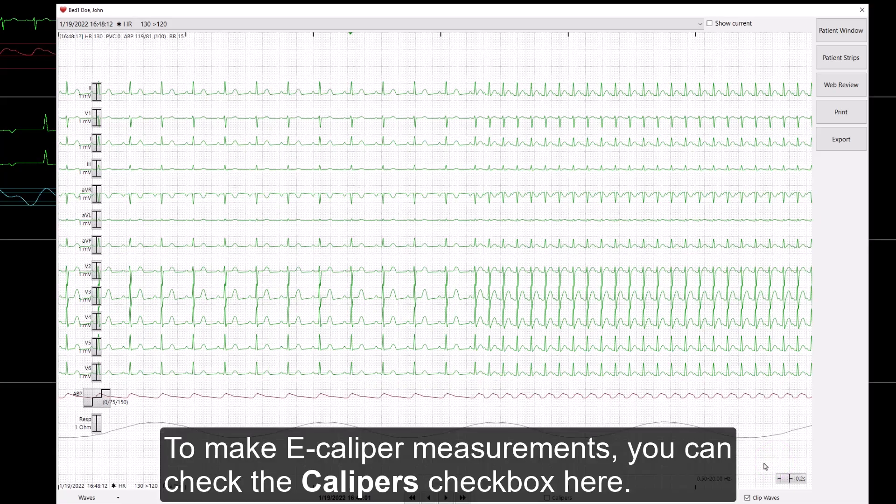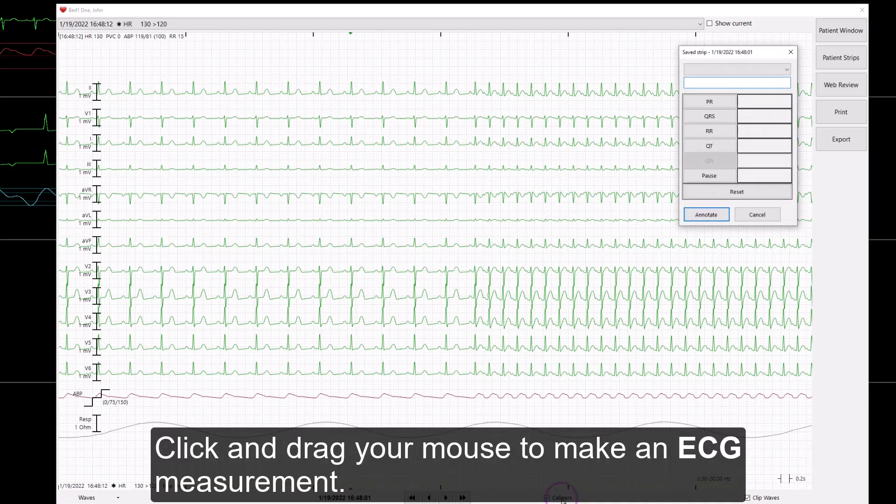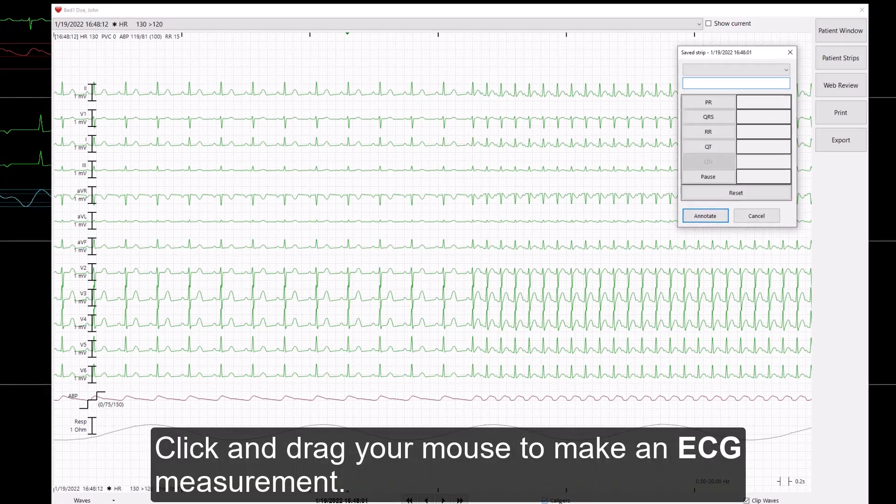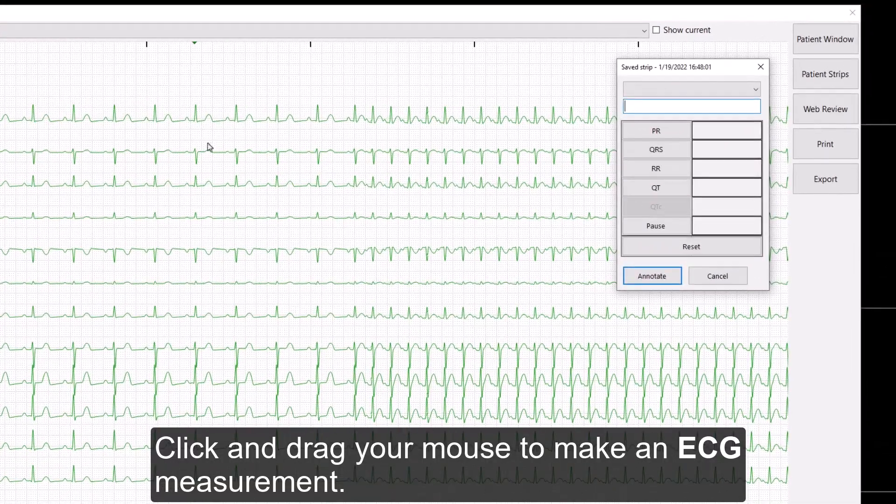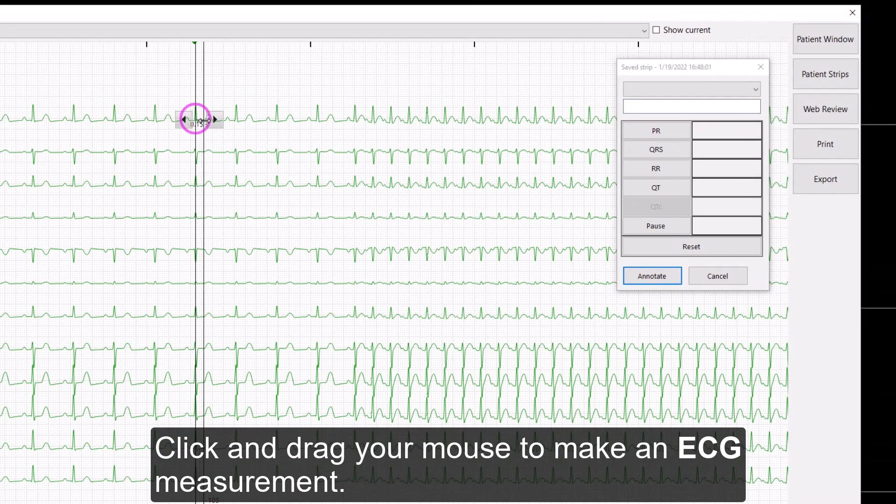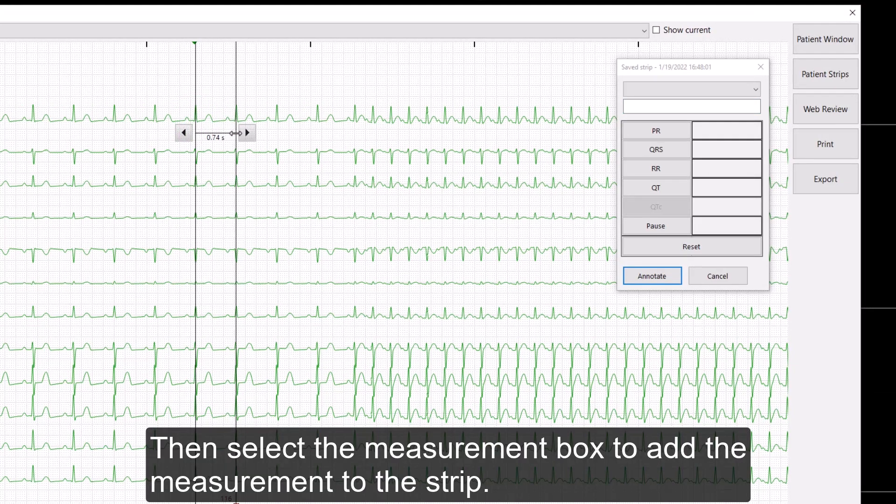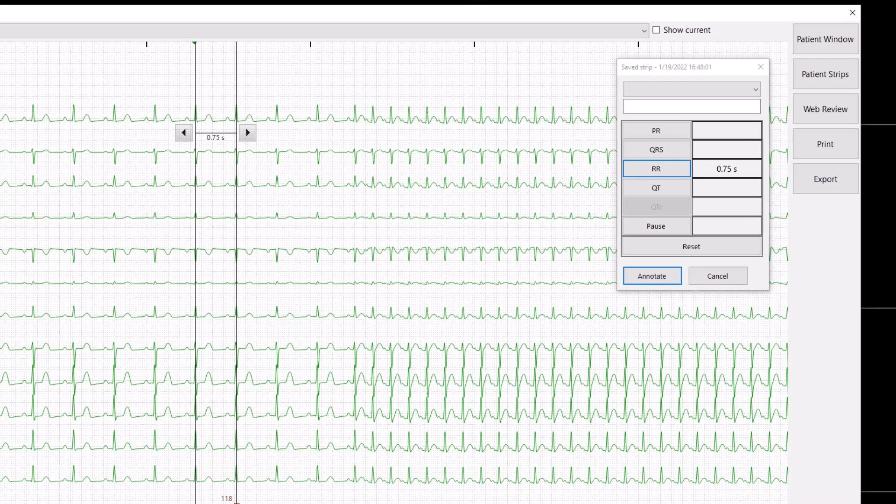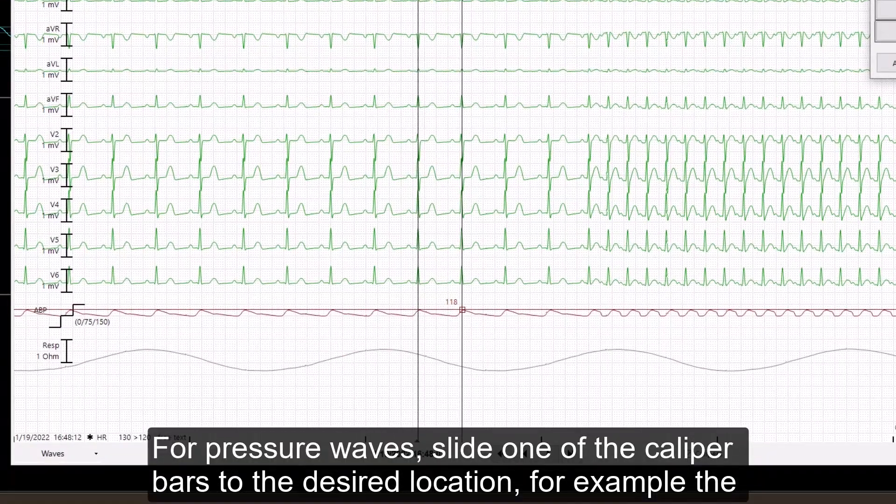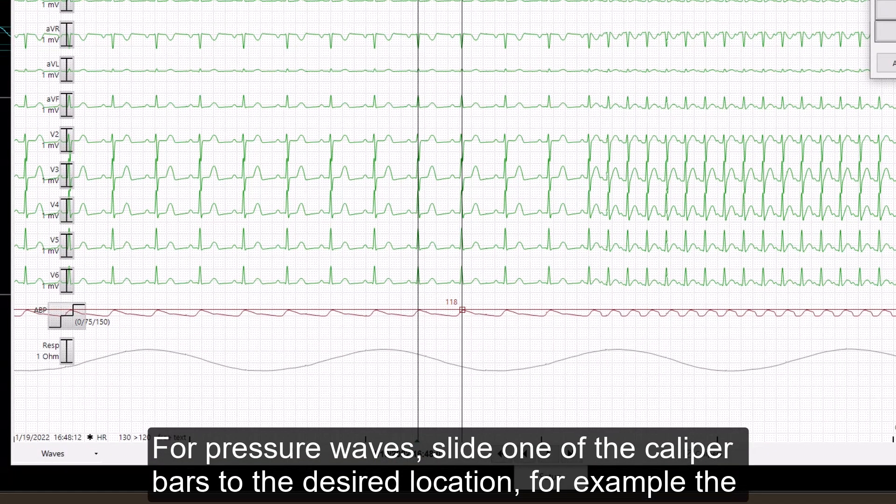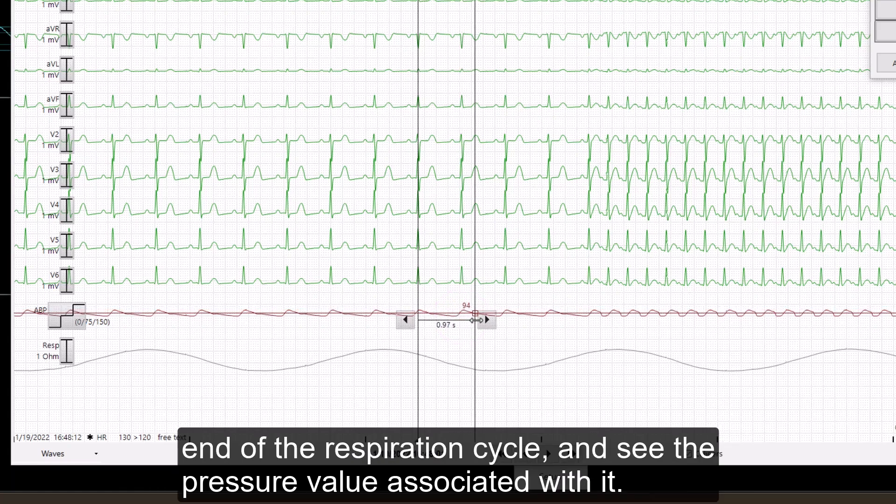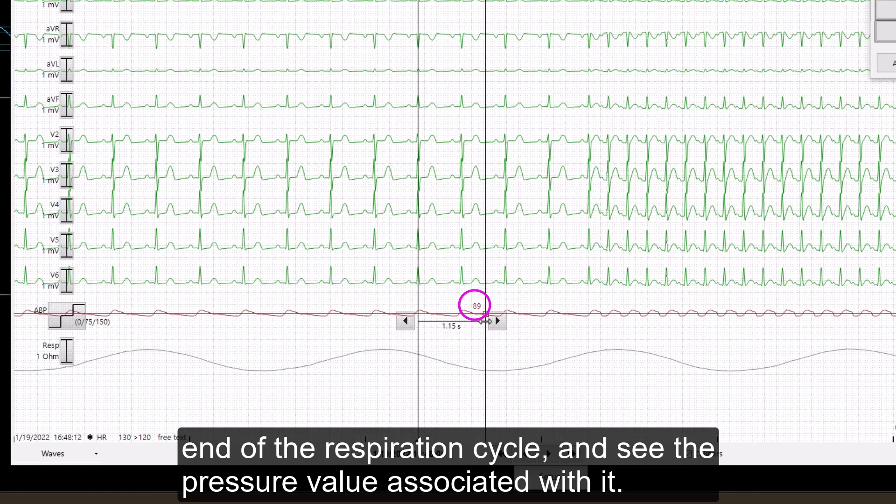To make e-caliper measurements, you can check the caliper's checkbox here. Click and drag now your mouse to make an ECG measurement. Then, select the measurement box to add the measurement to the strip. For pressure waves, slide one of the caliper bars to the desired location. For example, the end of the respiration cycle, and then see the pressure value associated with it.